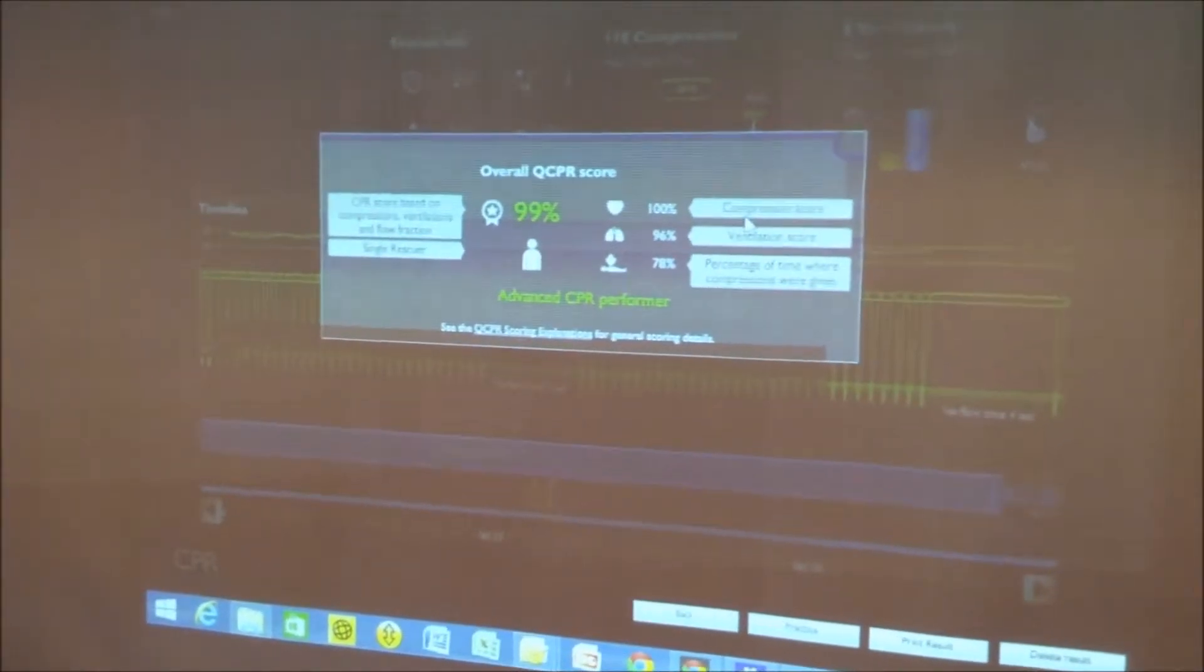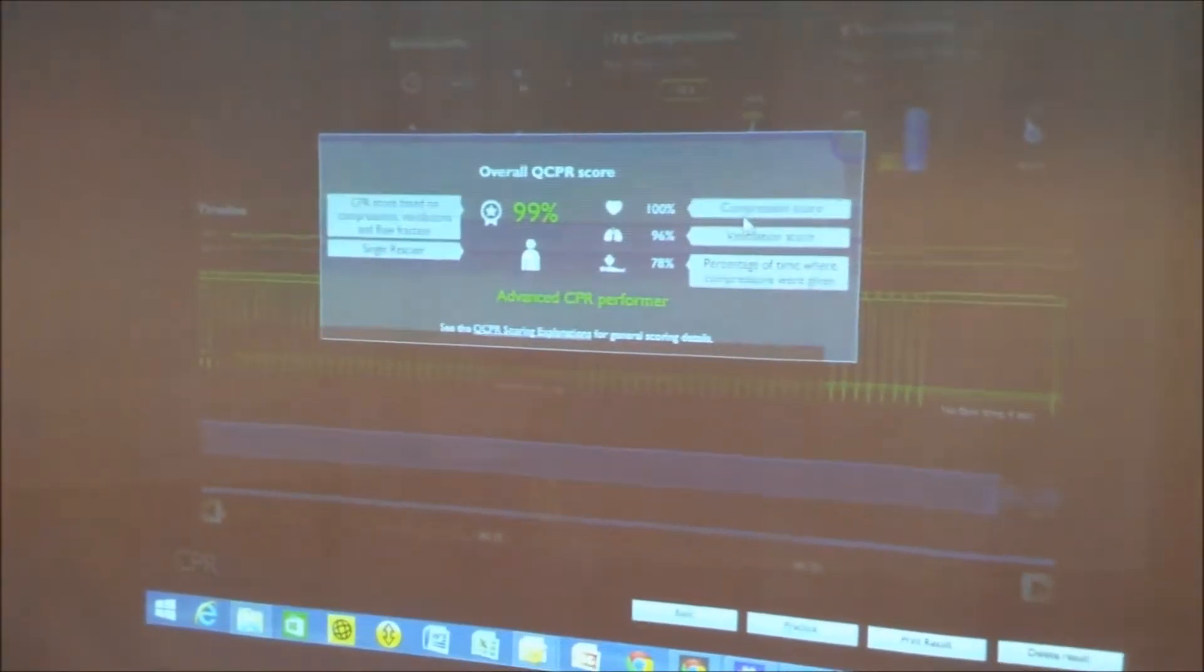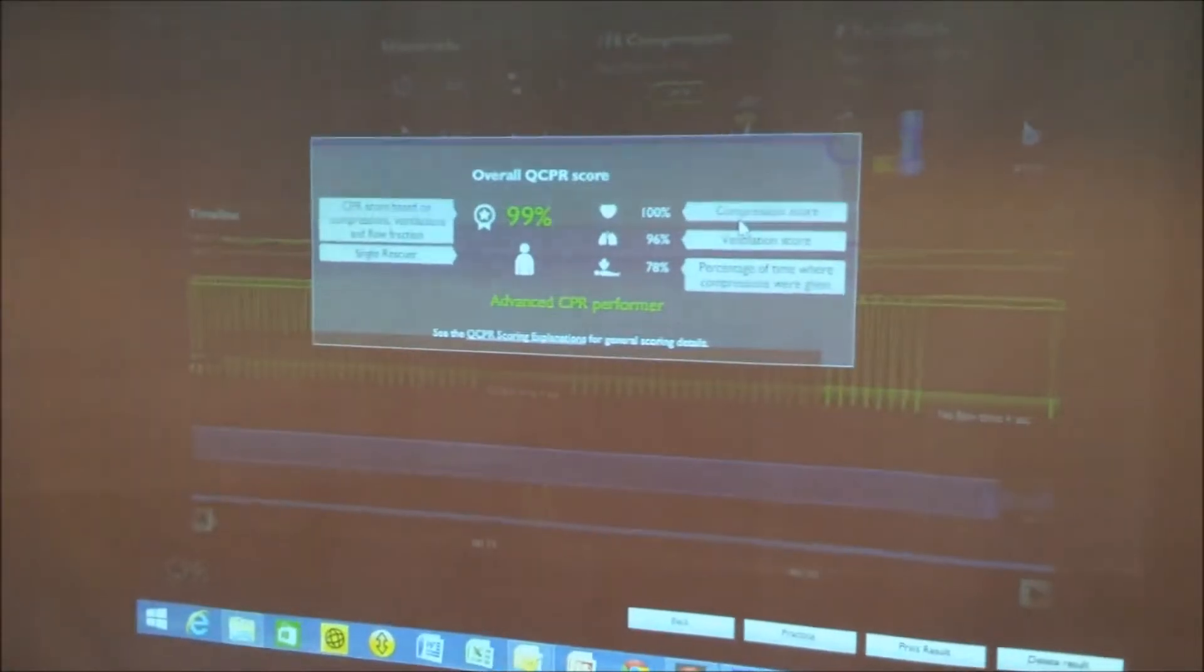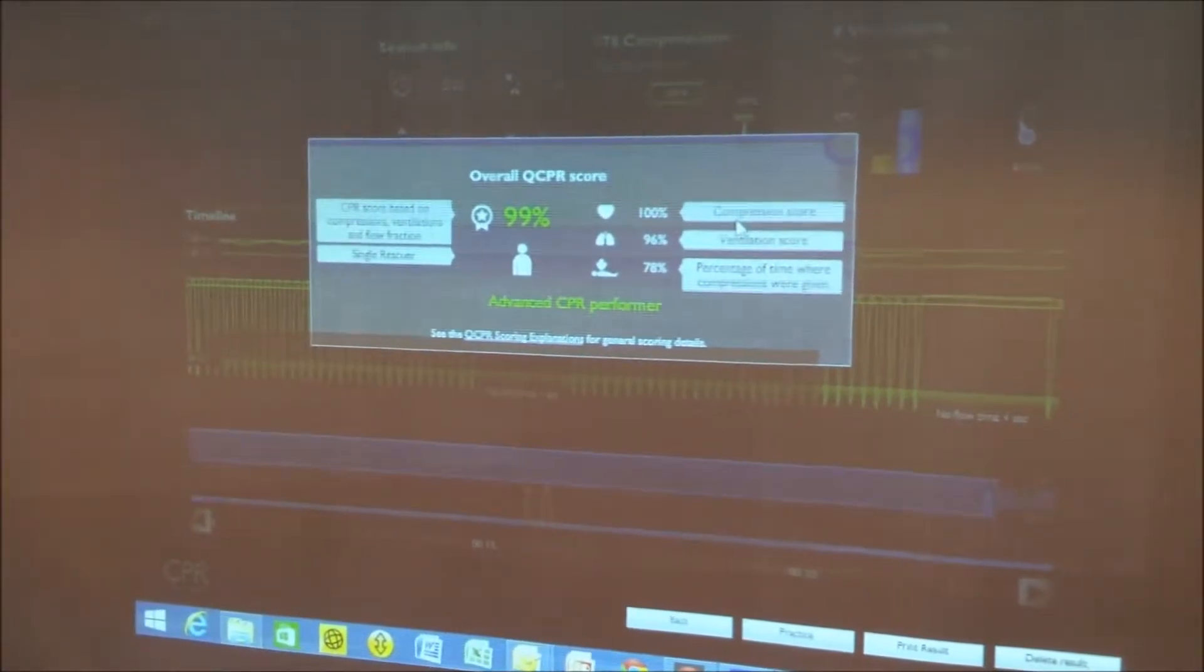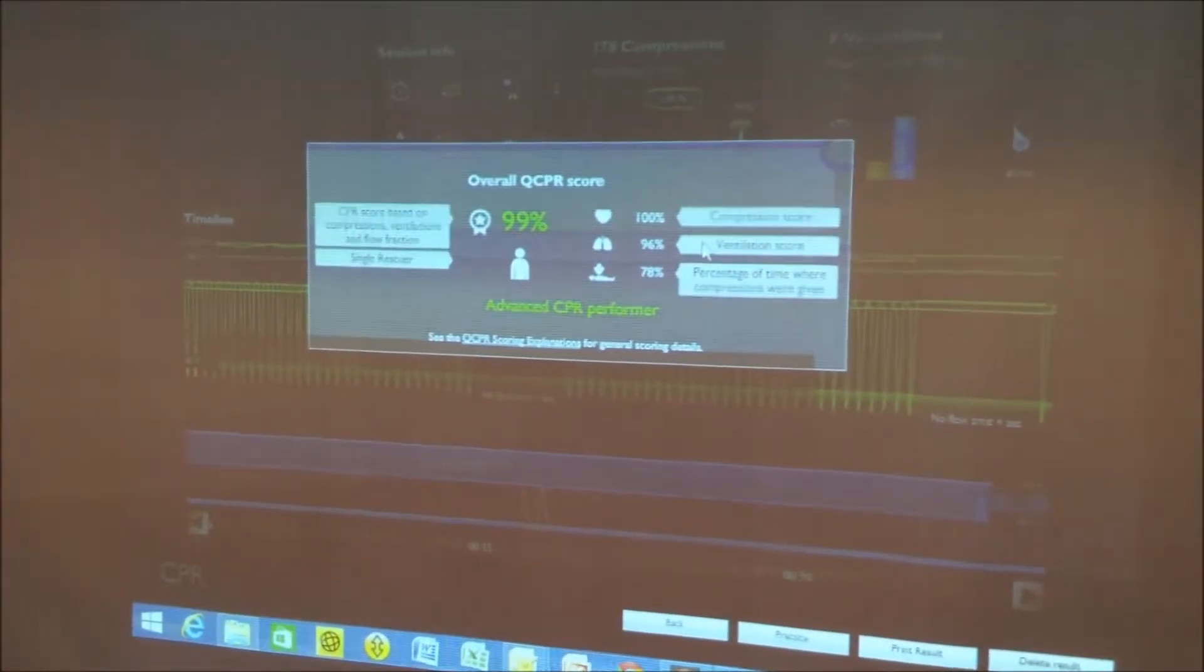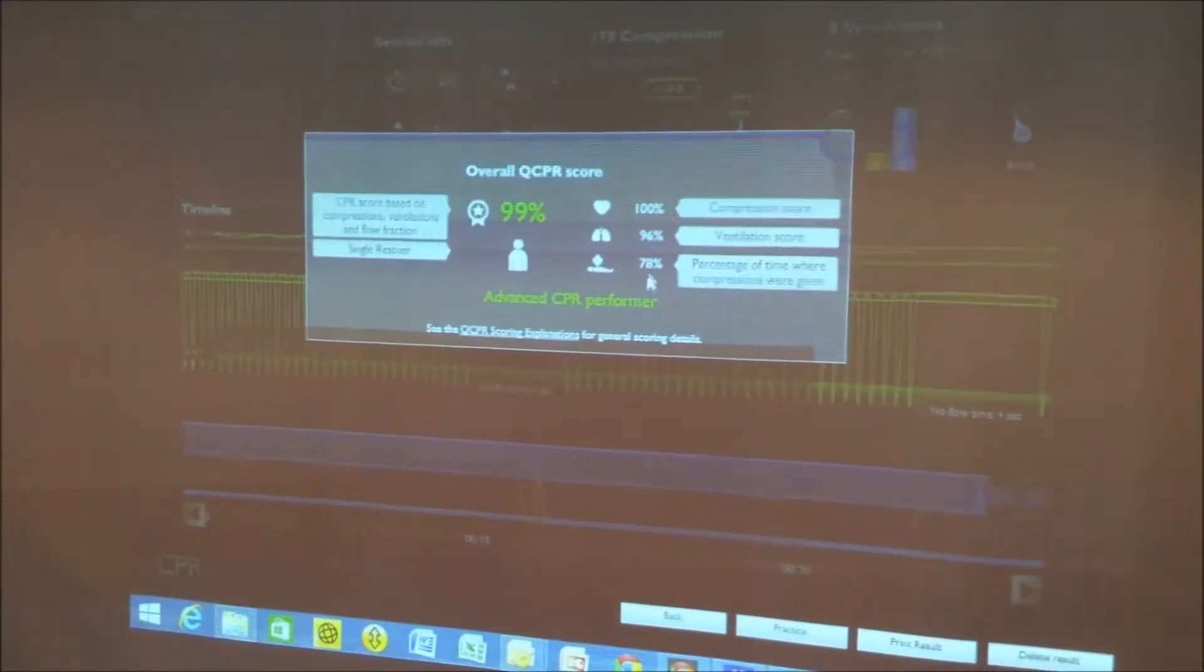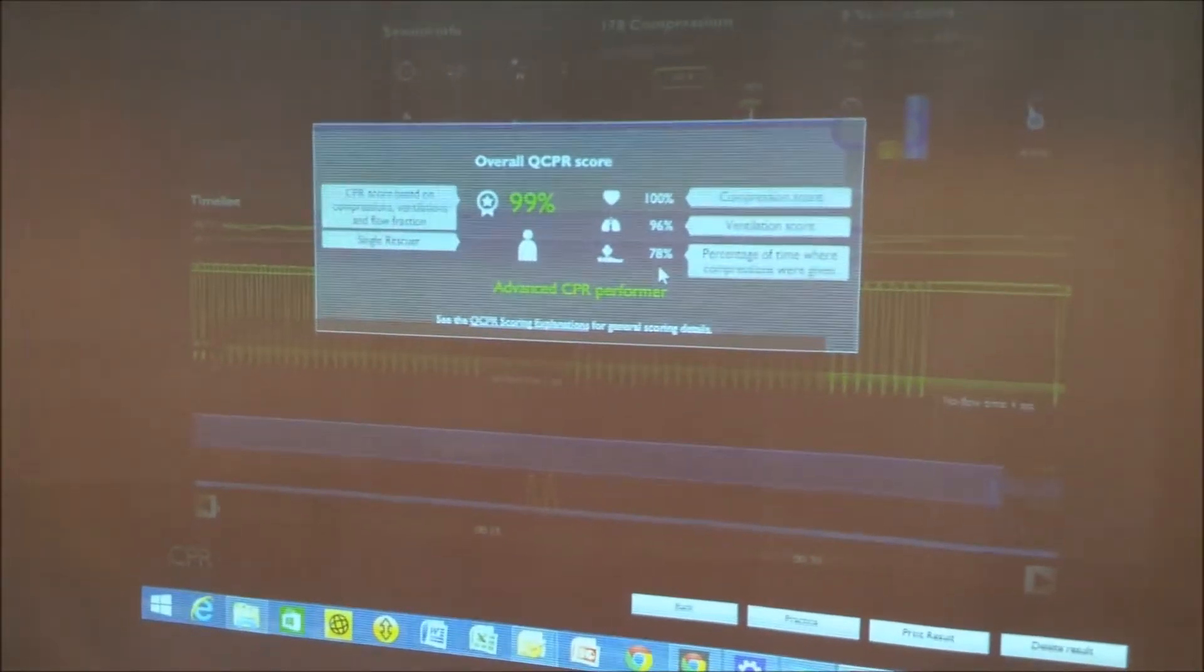That score was made up of 100% for compression so this person scored perfectly for every compression and release. 96% for ventilations but this is a really important indicator here.